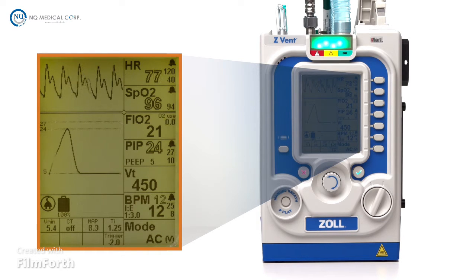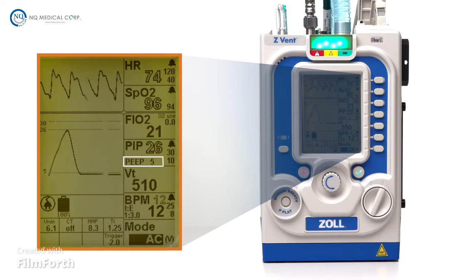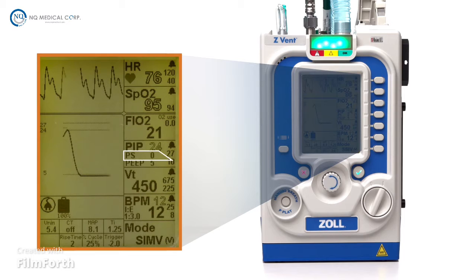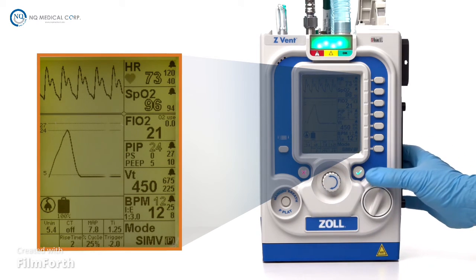window. The fourth window is peak inspiratory pressure, or PIP. Airway pressure settings are also changed from this window. This window displays the current PIP value, high pressure limit and low pressure limit alarms, and the current PEEP setting. When operating the ventilator in SIMV, CPAP, or BL modes, pressure support will be displayed as a secondary parameter that can be adjusted. When operating in a pressure-targeted breathing mode, PIP is a solid numerical value and can be changed.